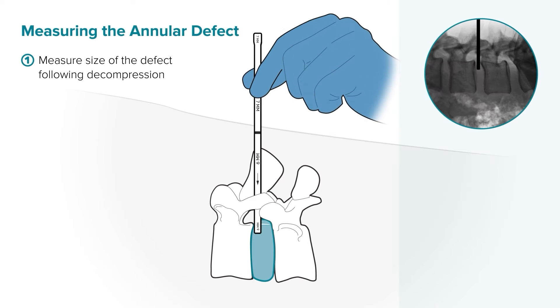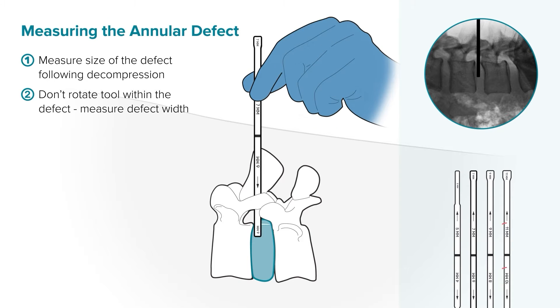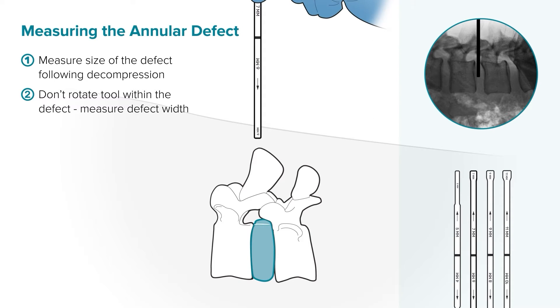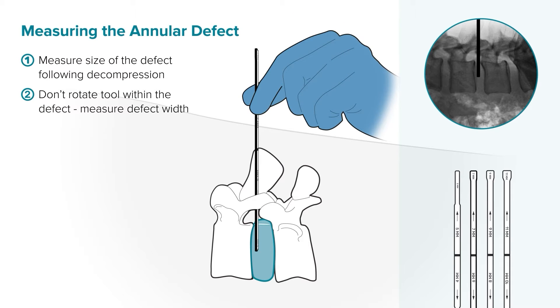Measure the size of the annular defect following your decompression using light insertion force. Do not rotate the defect measurement tool within the defect. When you are finished measuring the defect height, take the tool out of the defect before switching to measuring width.